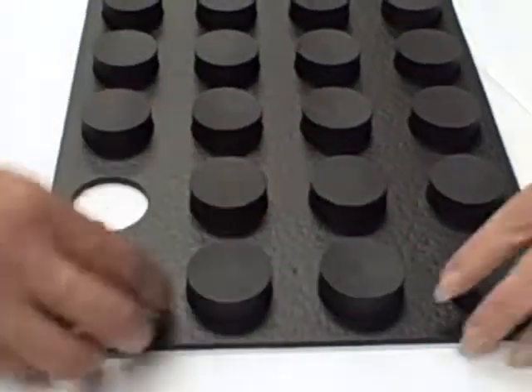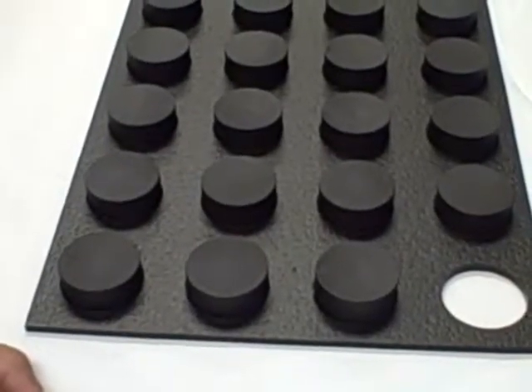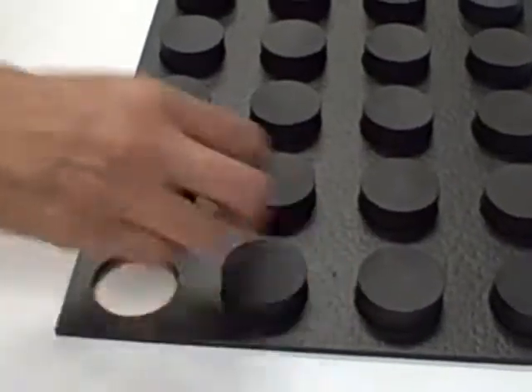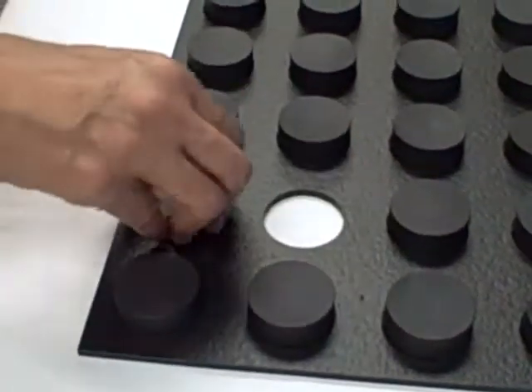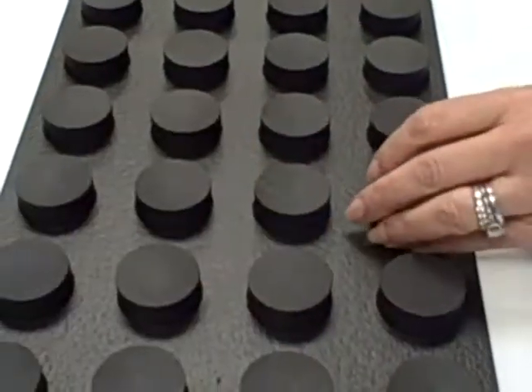Okay, so we'll have you here. So you would say, ready, begin, work as fast as you can. And that is called the displacing test. Okay, so we'll stop there.